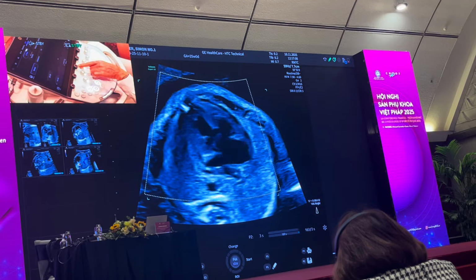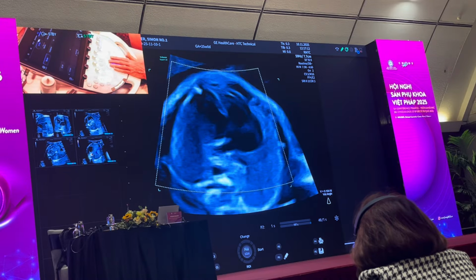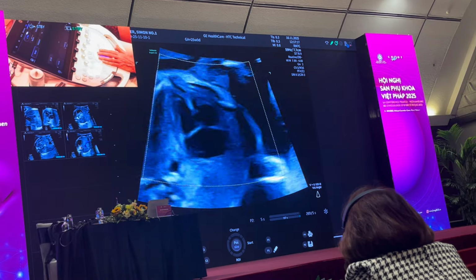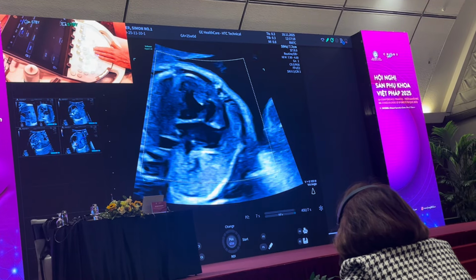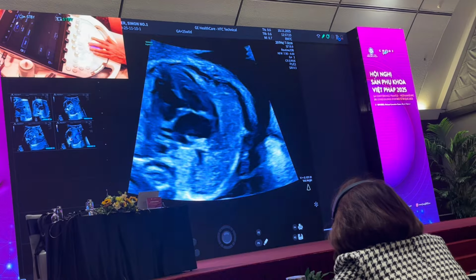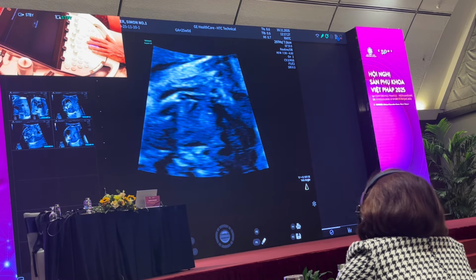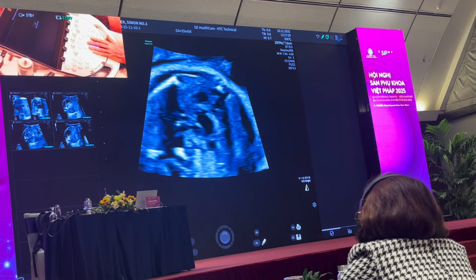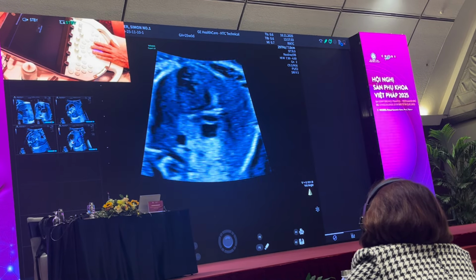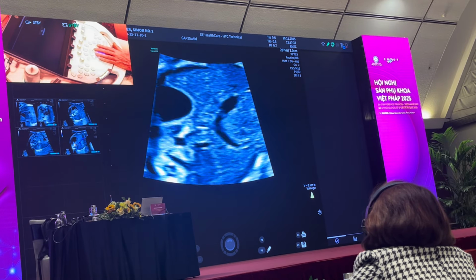I can select the acquisition time of 15 seconds, an angle of 40 degrees, and then I'm just going to get the position to get the baby's arm out of the way, with the arm over the chest. And with that position, I'm going to stop breathing. And then I count down: 5, 4, 3, 2, 1, breathing away. Well done.